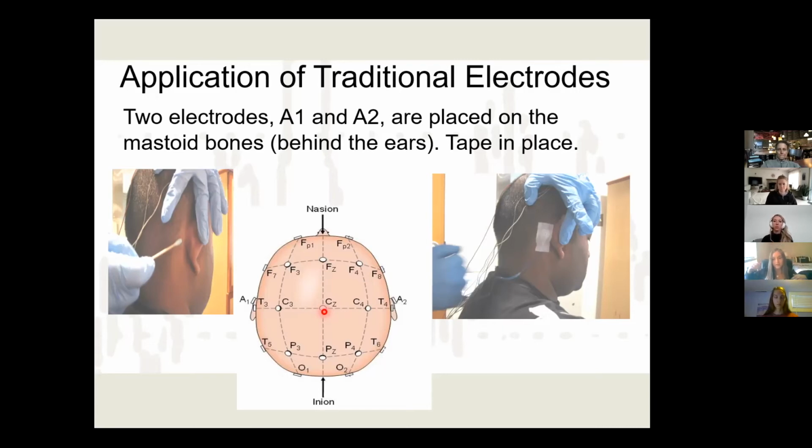So this is something you can consider when you're troubleshooting a PSG, if it looks really bad. If you're looking at impedances and every single electrode is over 100K, you're like, okay, there must be something wrong with one of these two electrodes, because it's very, very rare that all 14 electrodes would go bad at once.